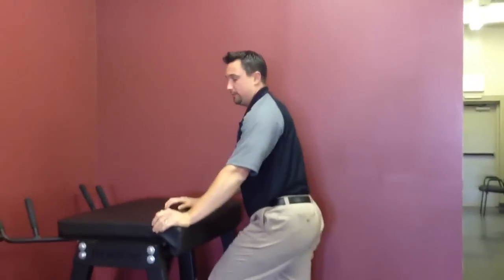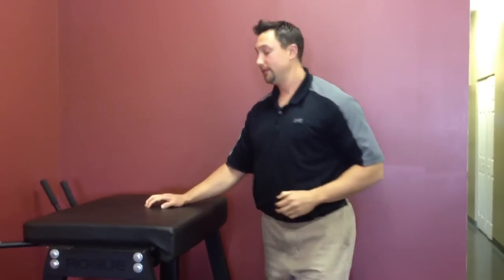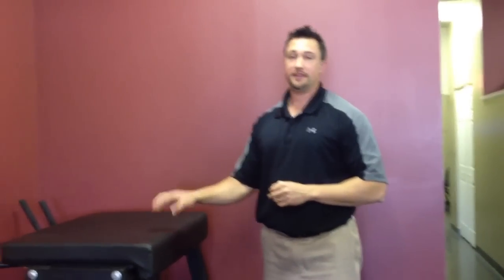Here at my clinic, we have patients do about three sets of 10, and then we work up to about four sets of 10. For any information on this table, visit us at westside-medical.com.